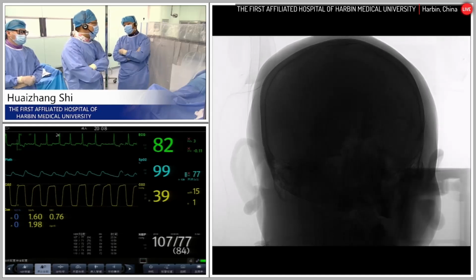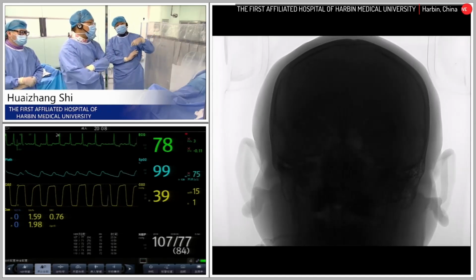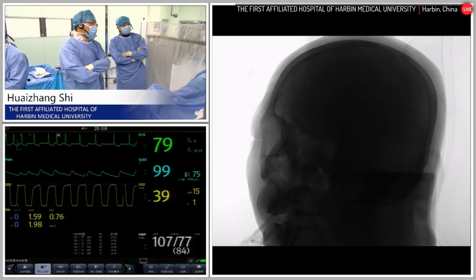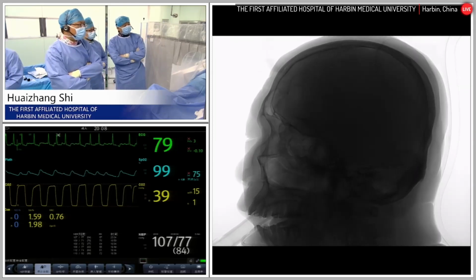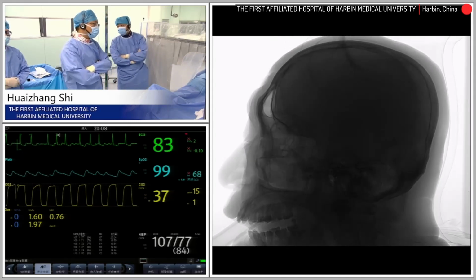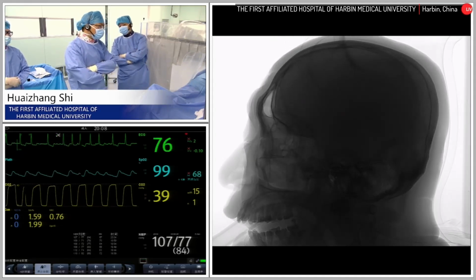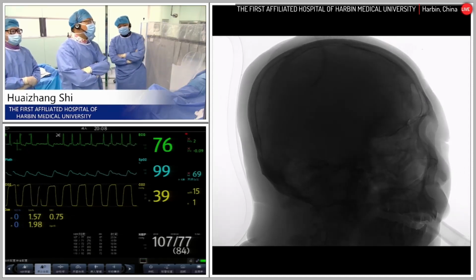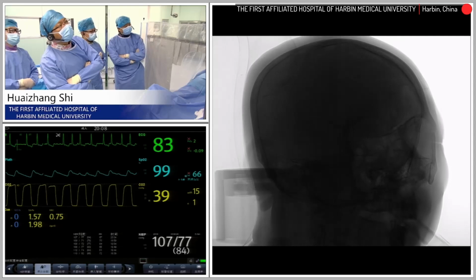It's not an easy case, I think, because there are two stents and two lesions in one artery. This is a very complex case. But I think with the new device, we decrease the number of exchanges, so that should decrease the complication rate. Yeah, check it.